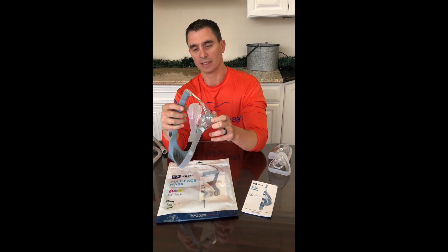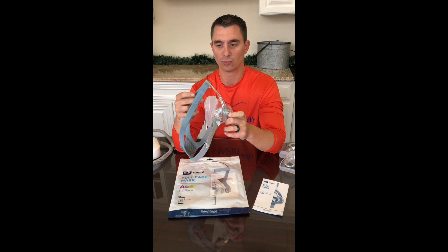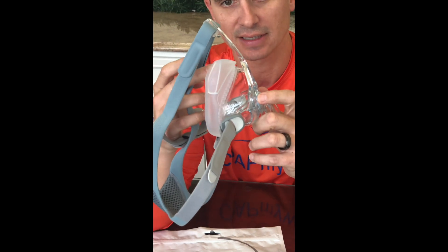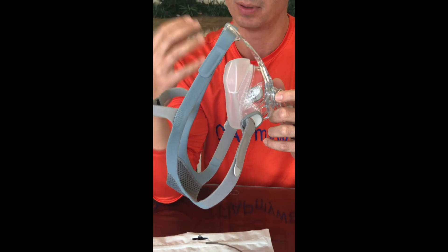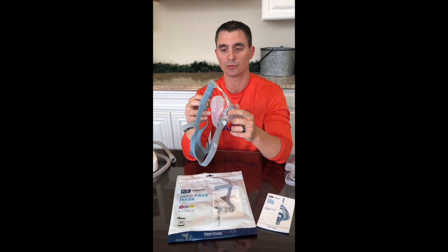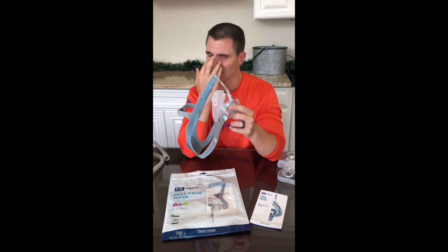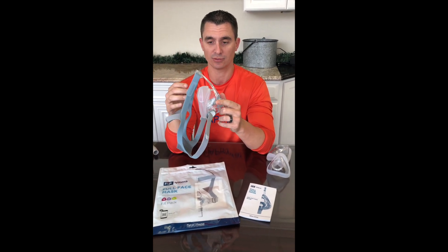The one thing that is really unique about this particular mask is the roll fit design. When I apply some pressure to where your bridge of the nose would be, the mask kind of rolls in, which gives a comfortable but more importantly effective seal at the bridge of the nose. So especially if you are one of the people that have encountered a lot of corner-of-the-eye leak because the mask just doesn't seal well across the bridge of the nose, this mask is going to be a great option for you.